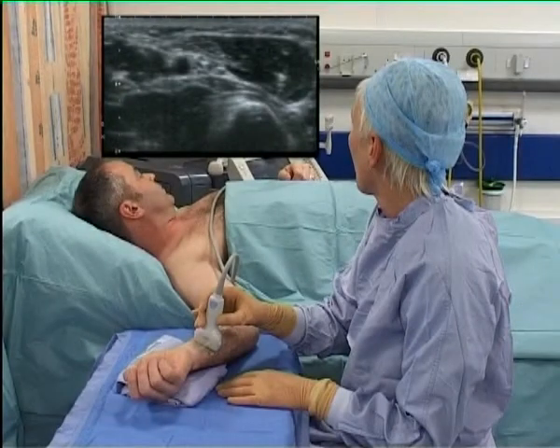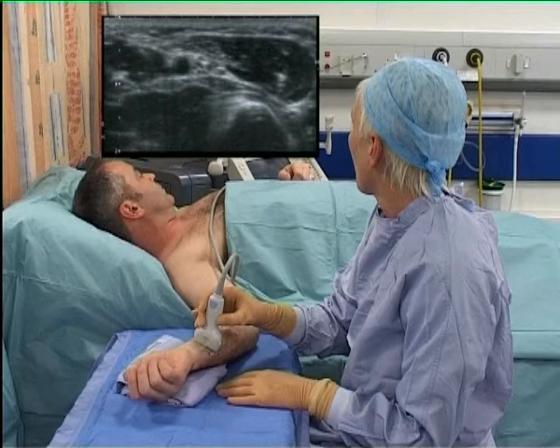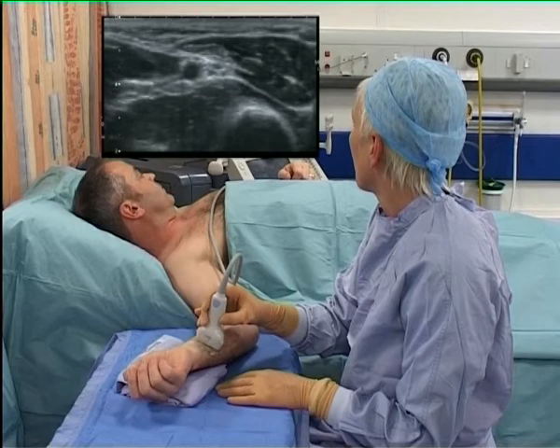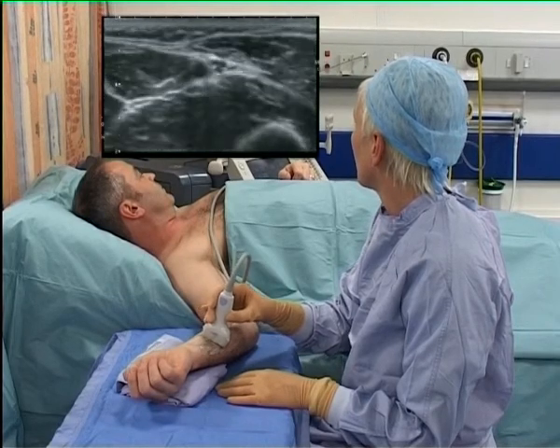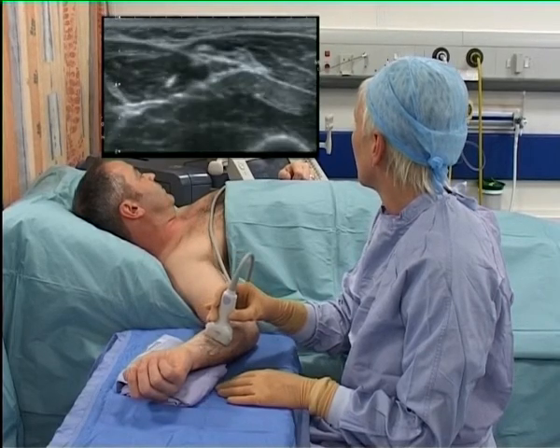The key internal landmark is the ulnar artery, a round hypoechoic black structure. Medial to this, on the right side here, the ulnar nerve appears as a hyperechoic, bright triangle with a honeycomb pattern.